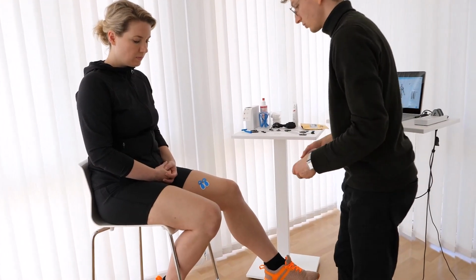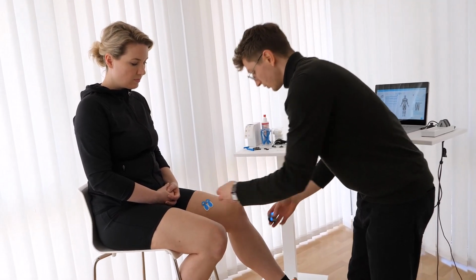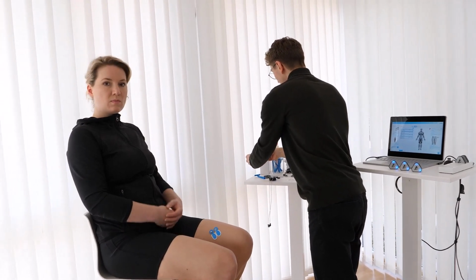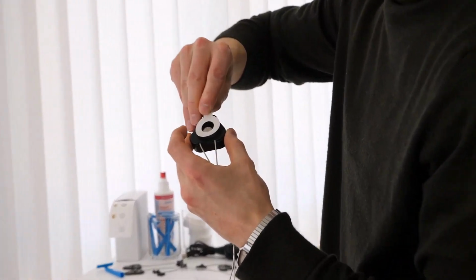The reference plate is attached to a bony point for which the software recommends the malleoli. However, we can also choose the tibia as a bony structure. We need an adhesive ring for attachment, which we apply on the back side around the aluminum electrode.